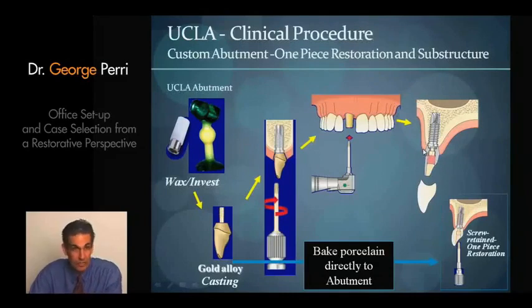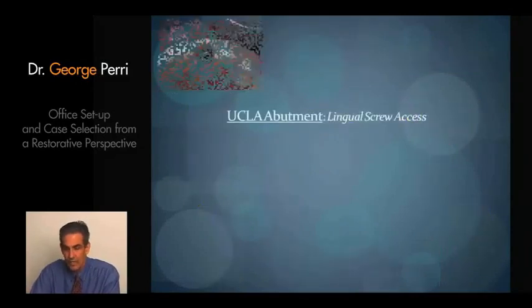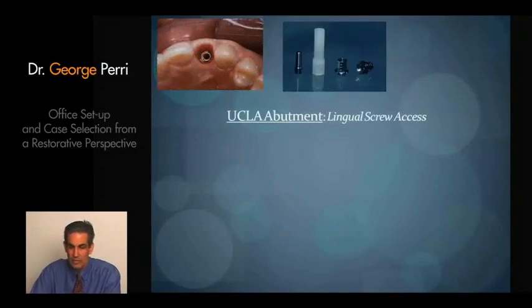In order to feel predictable as a restorative dentist in this regard, we need to feel that the soft tissue is stable. So when we get into the sessions in regards to anterior restorations, we need to talk about the time frames required to achieve that soft tissue stability before we make our final restoration. So we'll look at one other case just real quickly.